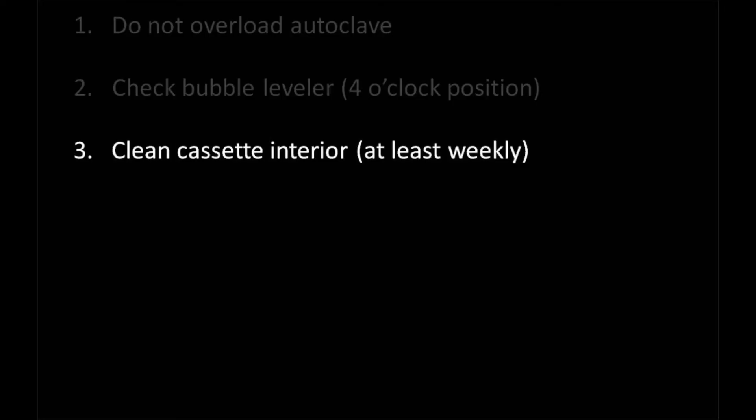Third, make sure the cassette interior is clean on a weekly basis. You can use mild soap with water, or if the cassette has a gold or brown cast to it, use a stainless steel cleaner like Bar Keeper's Friend to restore the cassette to a like-new condition. If the cassette is not kept clean, the rinse agent cannot perform properly.